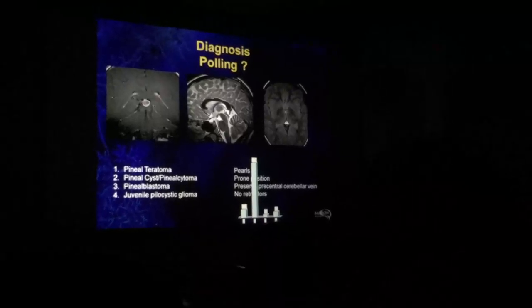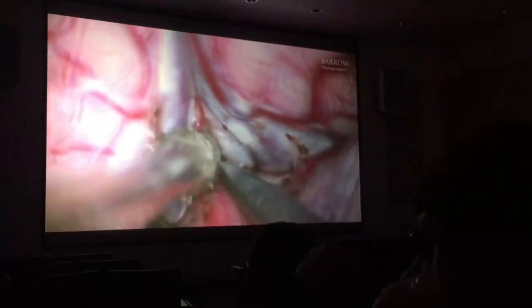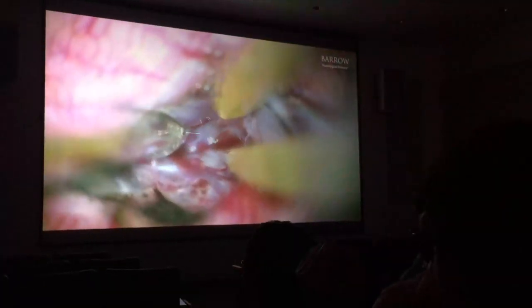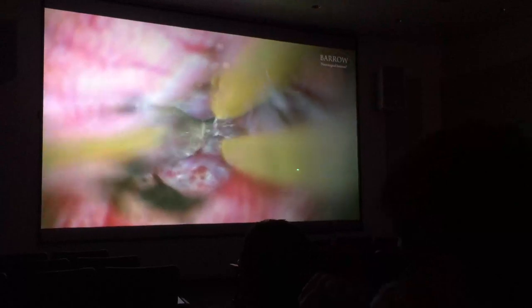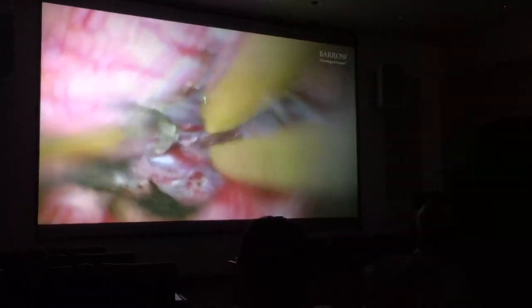We can go to the video. Very long, drawn-out incision — obviously you don't need anything like that. And here you are. This is the tentorium. Cerebellum. You're going down.